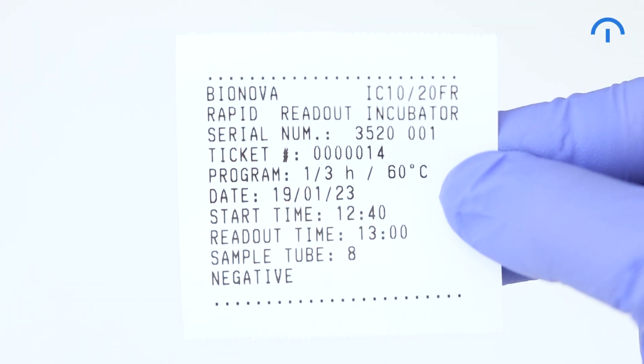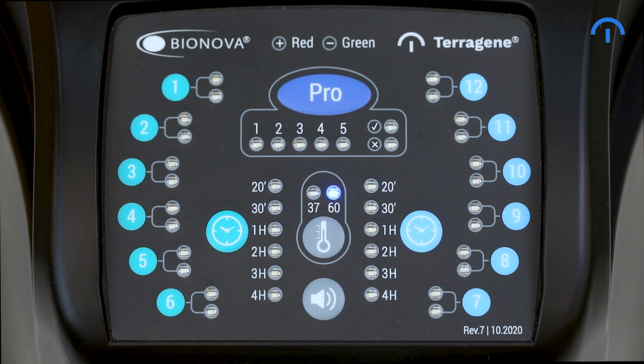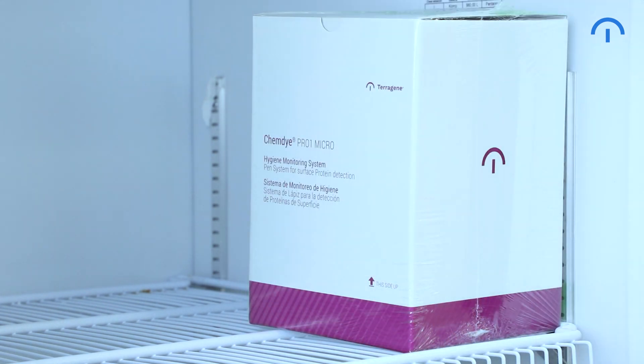Further details will be shown in the print ticket. For Pro-1 protein pen readout, the temperature must be set at 60 degrees Celsius. Remember that the Pro-1 pen must be stored vertically and refrigerated.